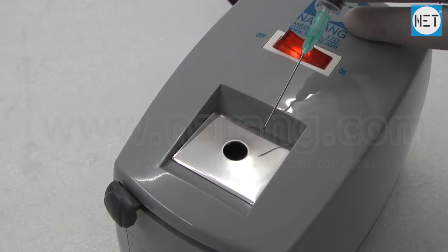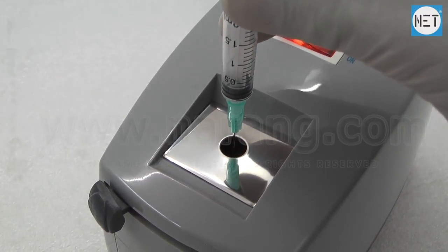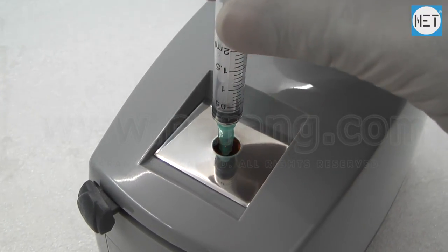Gently press the needle in the machine and slowly rotate it in the hole. The needle gets destroyed in 2 to 3 seconds.